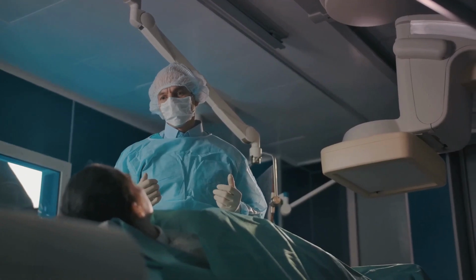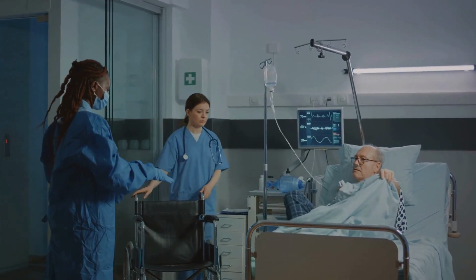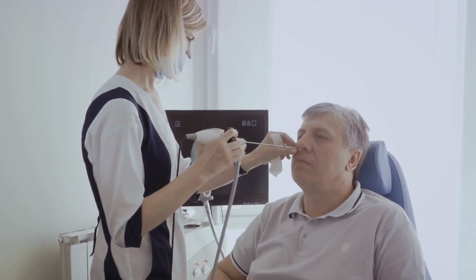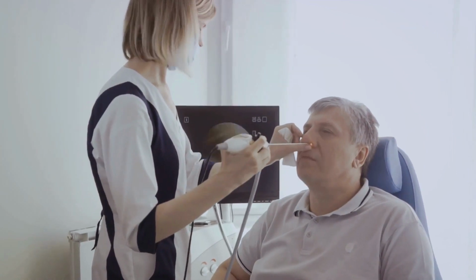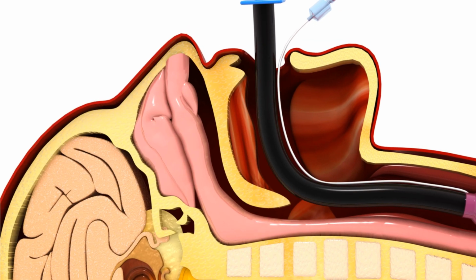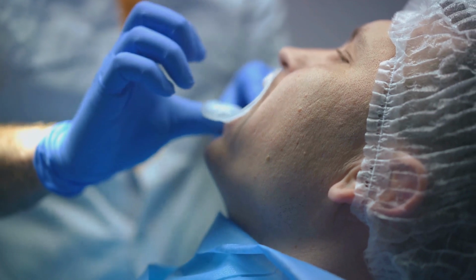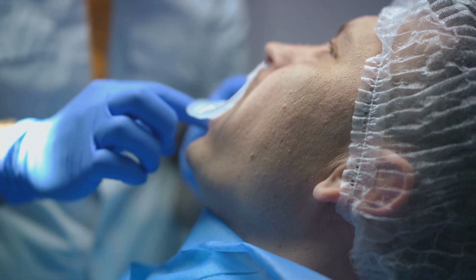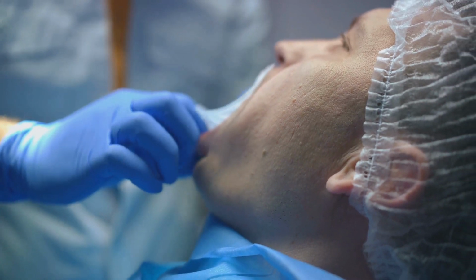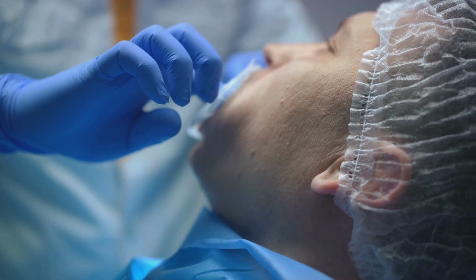The choice between these techniques often hinges on the specific circumstances and patient's condition. Direct laryngoscopy, for instance, is generally the go-to method for most anesthesiologists. It's a technique that's been around for decades, and the familiarity it brings is often a comfort in high-pressure scenarios. However, this method may not always be suitable, especially in patients with limited mouth opening or those with an unstable cervical spine. On the other hand, nasal fiber optic intubation, while more technically demanding, can offer a safer and more comfortable alternative for patients with difficult airways.